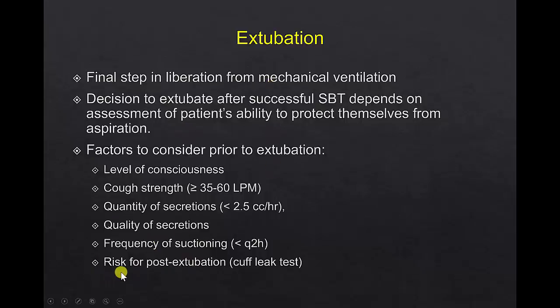Another thing we sometimes think about is cuff leak test to look for the risk of post-extubation airway edema. So the idea is if you can deflate the cuff and the person can breathe around or talk around the tube when the cuff of the tube is deflated, it implies there's a lot of air space left, that's not a tight fit, and that the airways are not swollen right up to the size of the tube.